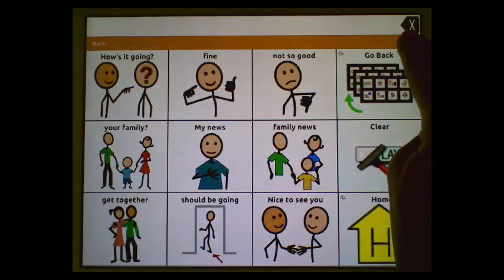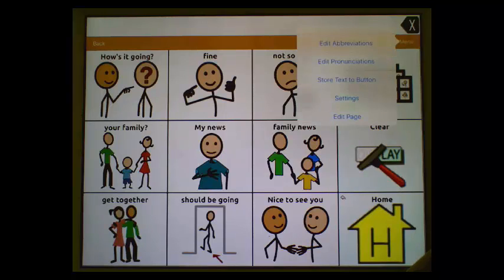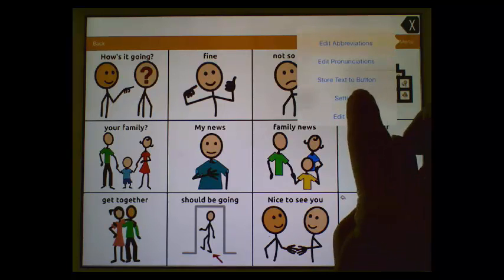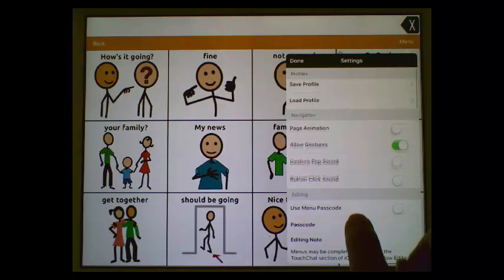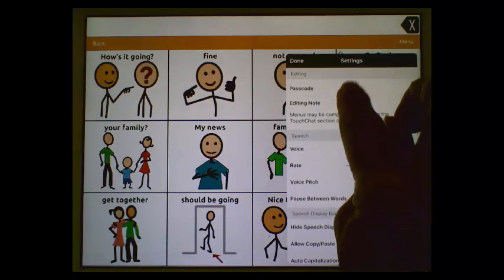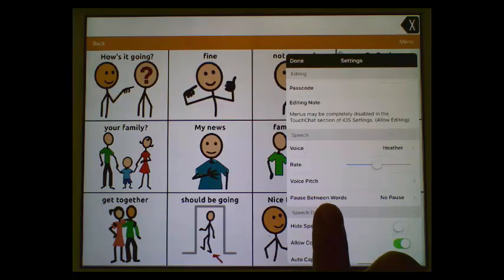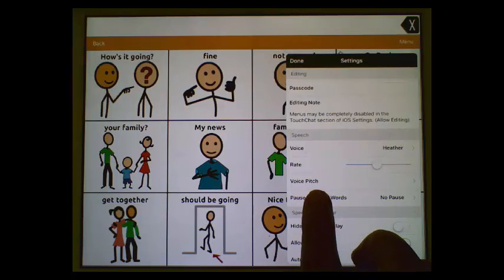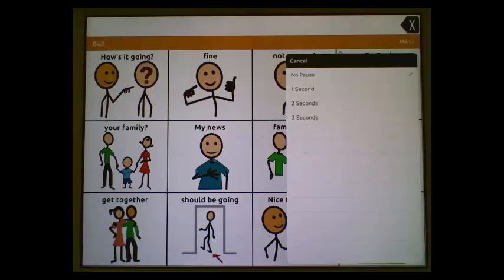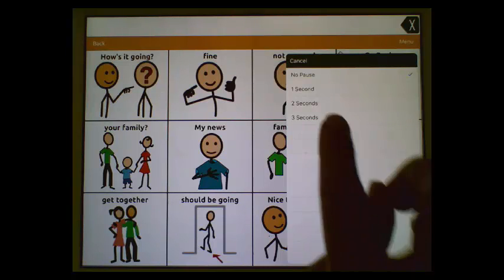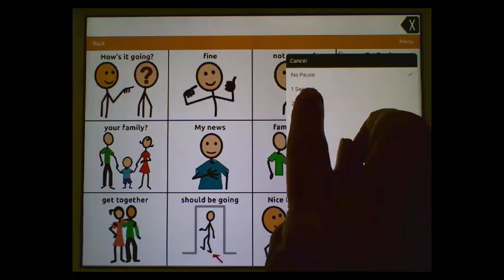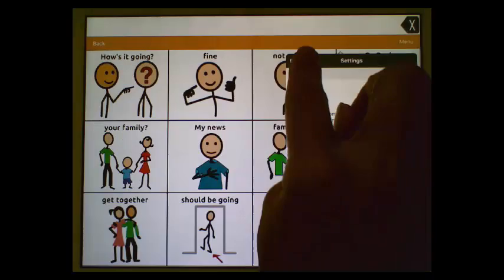Tap menu, settings, scroll to the speech settings, and we find pause between words. We can add between one and three seconds between words. Let's go ahead and add two for this example.